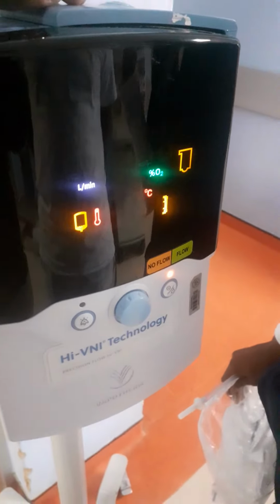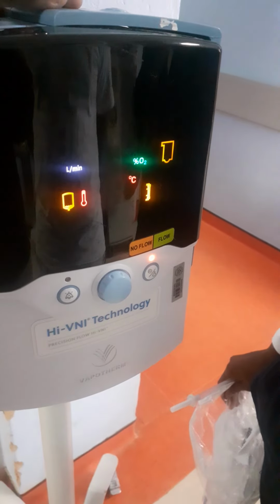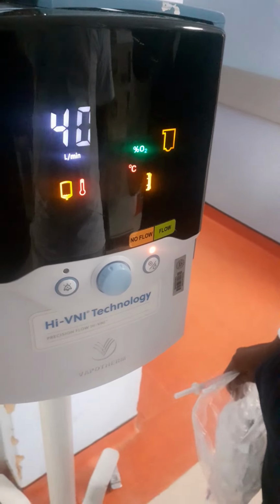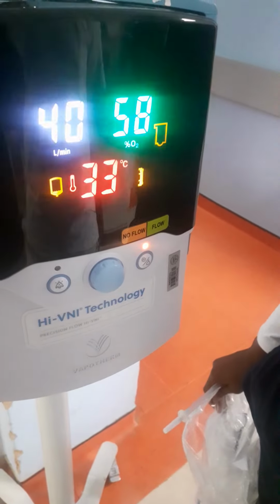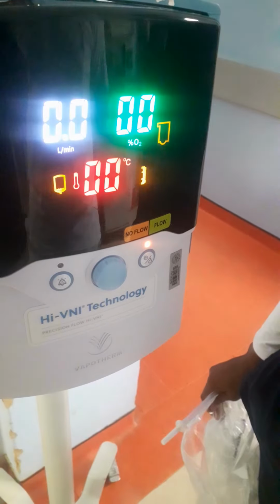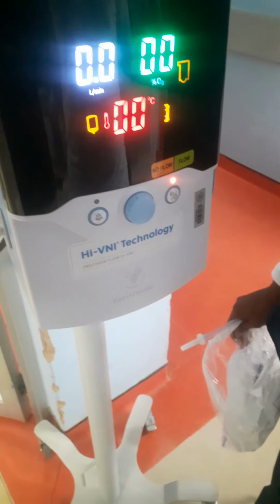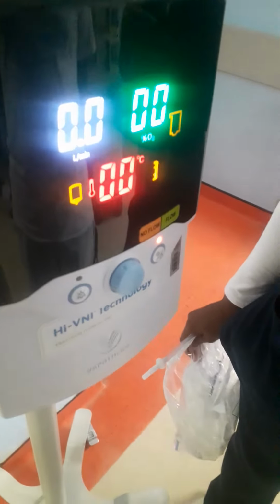And then I communicate with the patient. I tell them we're giving you some more air, okay? And then actually they will be responsive. It's not like a comatose patient. So that they can be prepared mentally, because if I just do it, they'll be shocked at what's coming in. Remember, our patients are still like us. We have to treat them how we want to be treated.